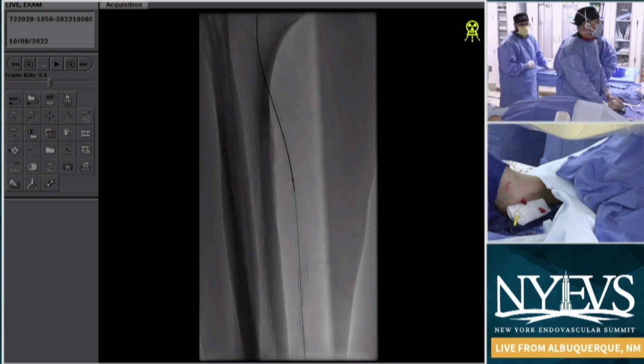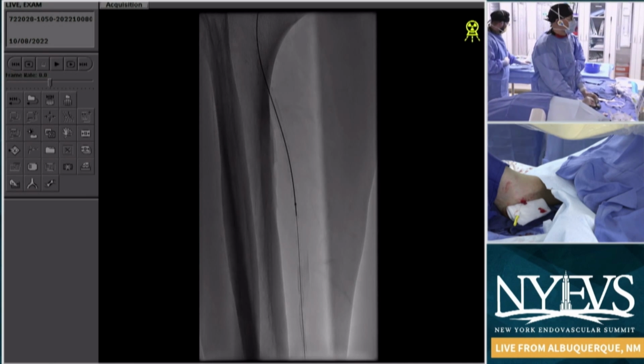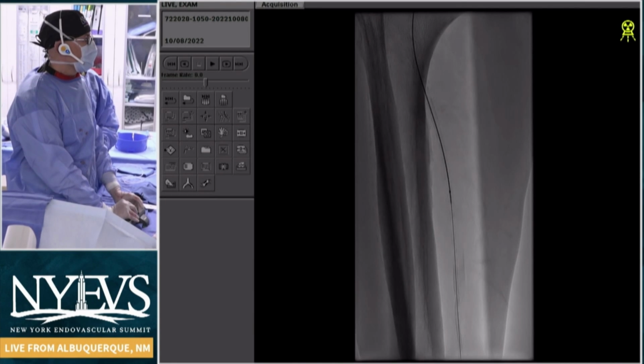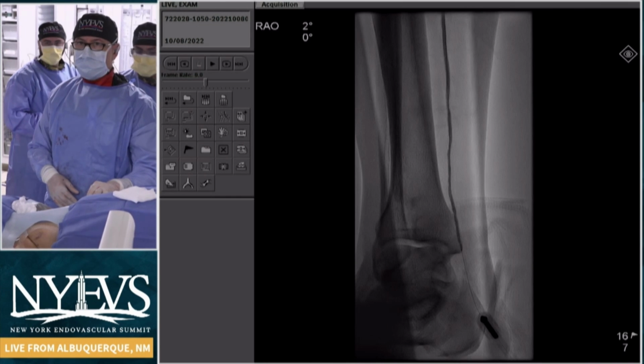Yeah, so obviously Steve's using the CSI Diamondback. It's an orbital atherectomy device. It may be inflow, but it looks like there's probably some SAD, or small artery disease, below the ankle, like Art Lee had talked about. Maybe, Steve, while you're doing this, we're going to get to our first couple of talks real quick, and we'll come back to you if that's okay. Beautiful. Okay. Tell us where you're at this point.